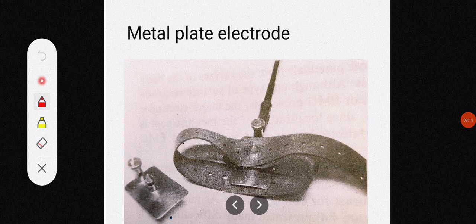So the use of adhesive tape and nutmeg grater actually reduces this movement artifact by limiting electrode movement and reducing interface impedance, but neither is satisfactorily insensitive to movement.